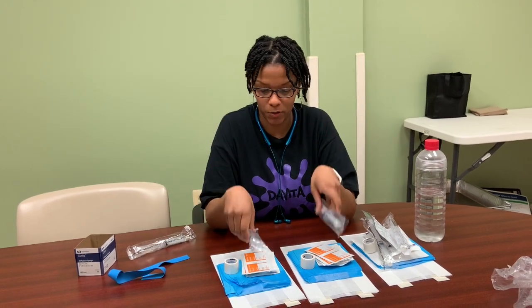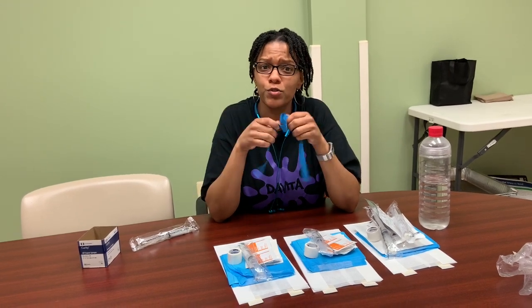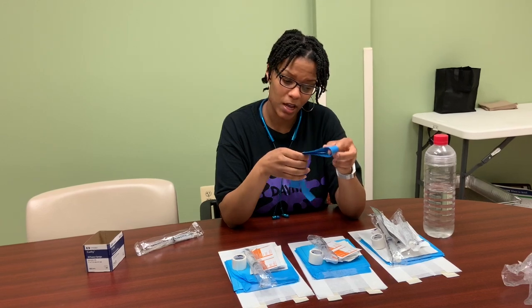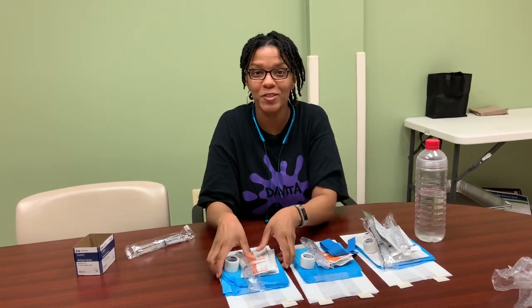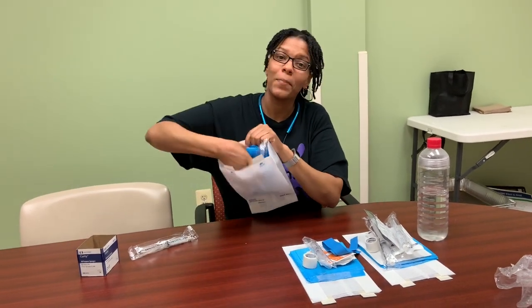I also have other salines for our needle fistulas, but these are used at the end of treatment when we're rinsing them back and getting ready to take them off the machine. We have tourniquets as well — if you've gotten your blood drawn, you know the nurses use this to tighten your arm to get the vein to pop. One thing I did forget was the actual needles — my bad — but all of that goes together, and once you get your pack ready, bam!